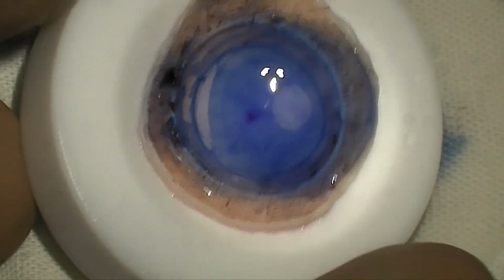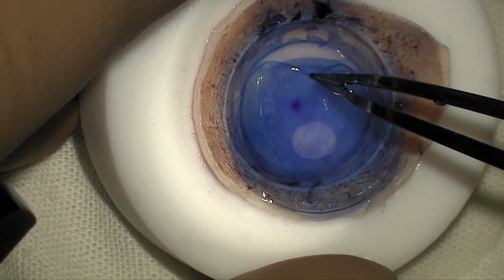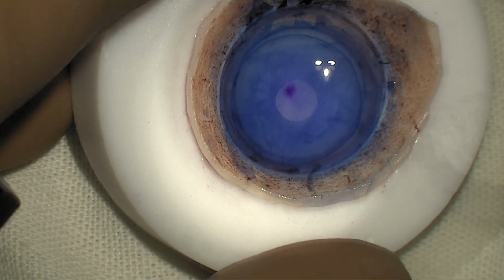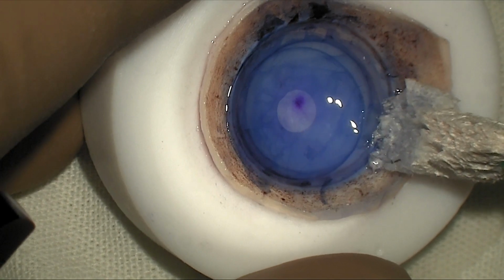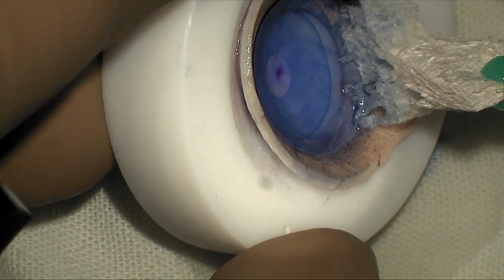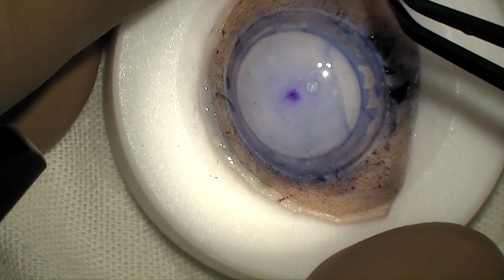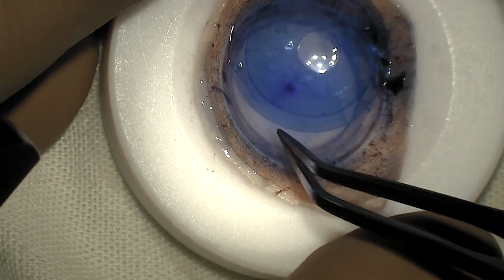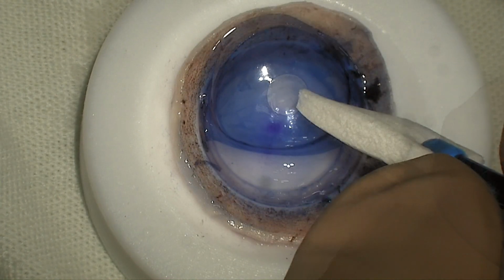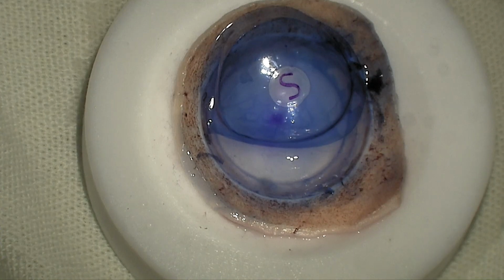The hinged part of the donor graft is then separated, and the entire DM endothelium graft is gently centered on the BCL. The interface fluid is soaked so that the graft sticks to the BCL due to surface tension. Now the BCL supported tissue is flipped over and air is trapped so that it doesn't collapse. The exposed Descemet is dried carefully through the 3 mm window, and the S stamp is placed as usual.